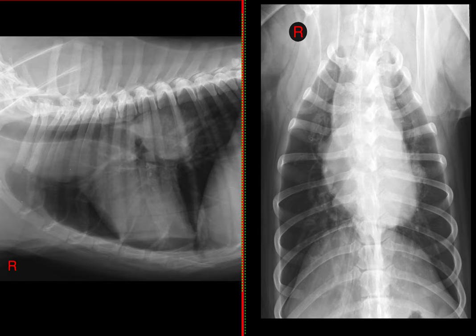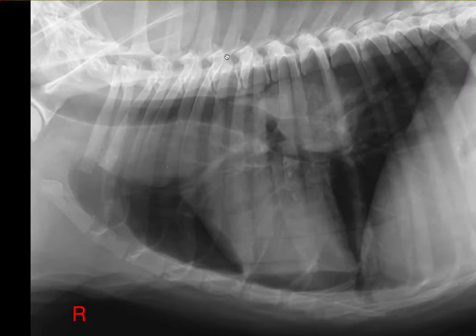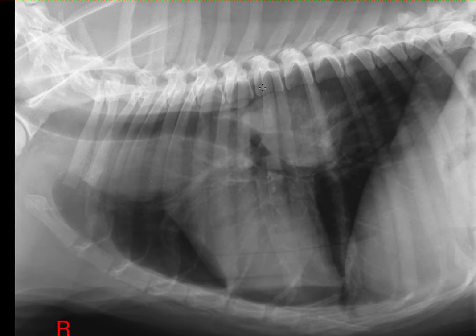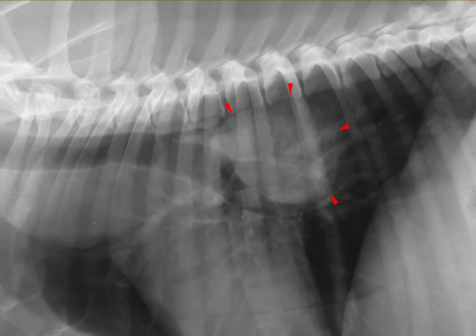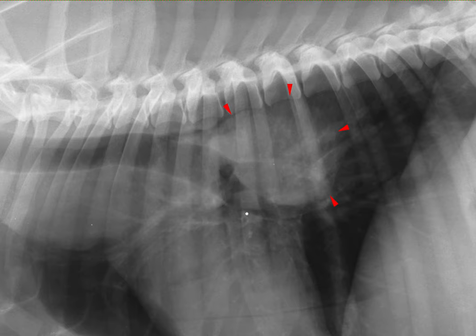I will highlight the most important findings on these thoracic radiographs, and we are going to start by taking a closer look at the right lateral view. The first thing that I noticed is this soft tissue opacity located caudal and dorsal to the heart. If you look ventral to the mass, you will notice the left caudal bronchus, which is severely pushed in a ventral direction. This is what we call a mass effect, and it helps us identify the origin of the lesion.